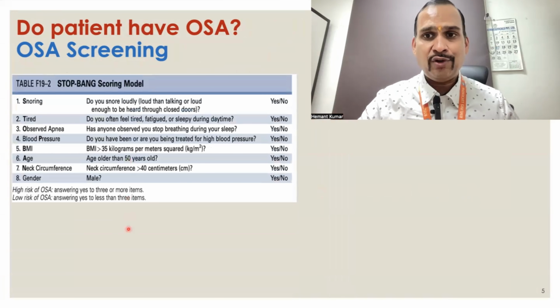Because whenever the patient has apnea or hypopnea, there is reduction in airflow, which reduces oxygen saturation, SpO2. In a sleep study we can see how much desaturation the patient gets, minimum SpO2, SpO2 below 90%. I have included all these in sleep report interpretation. You can check my YouTube channel, where I have discussed individual parameters.